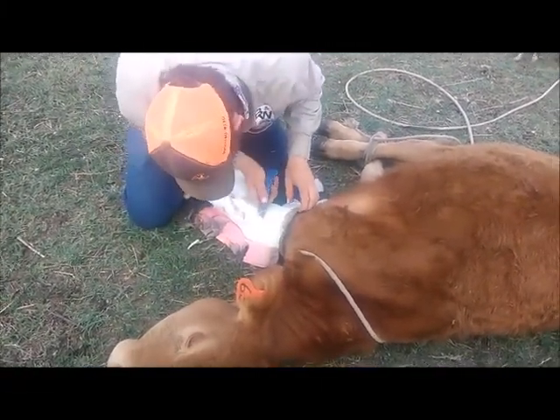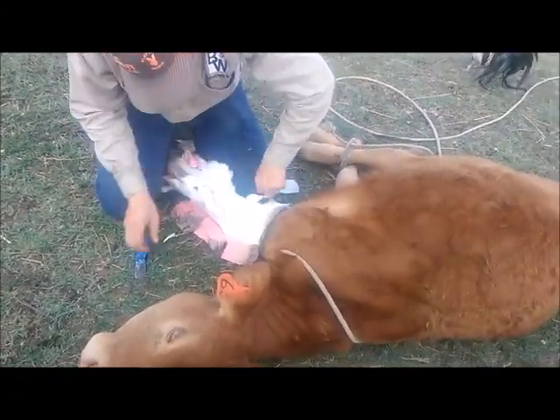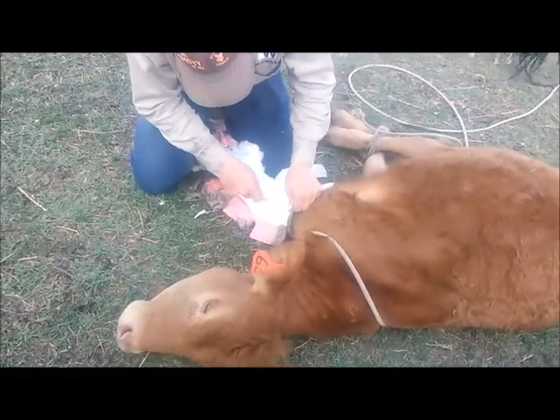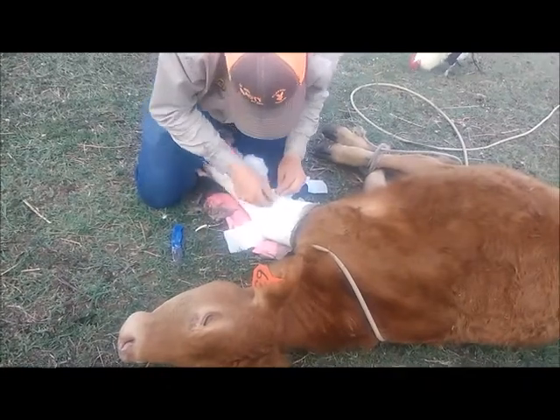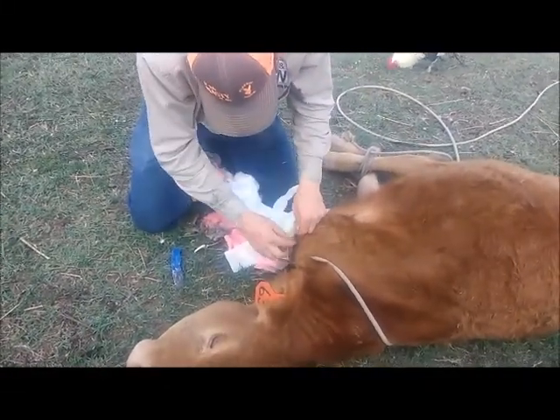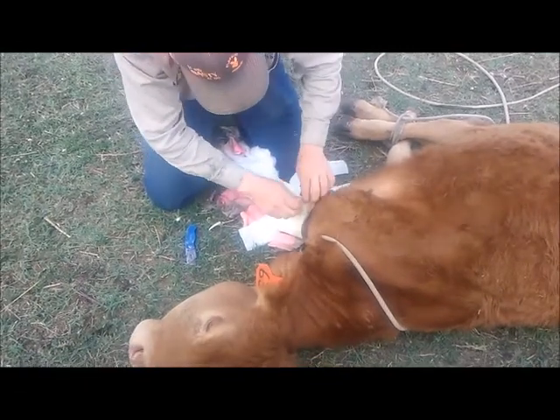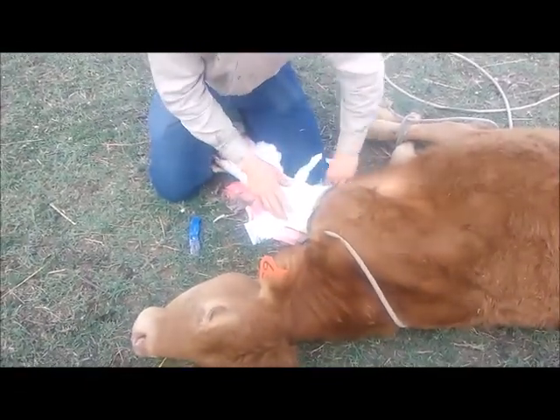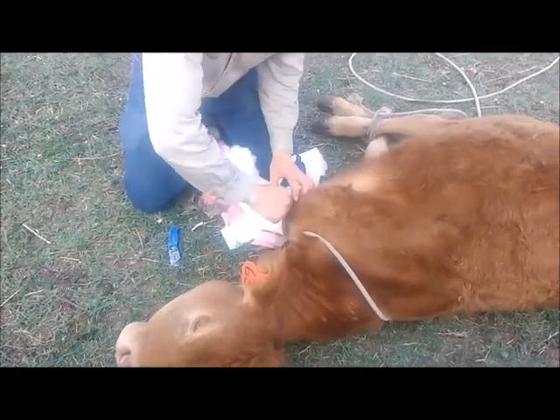Now, in case the other video didn't work, why are we not using some tool? Because it would cut her. A calf is not going to lay there all nice and quiet if you've got a buzz saw coming at them, correct? And she's tied down for her own safety, correct? Yes.